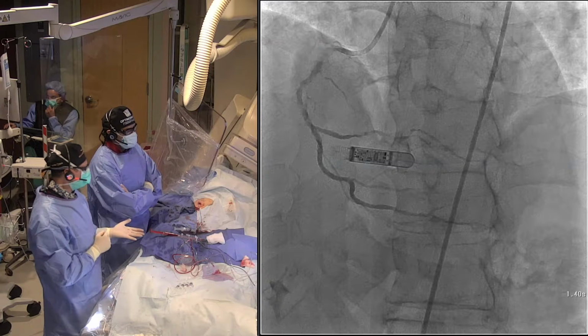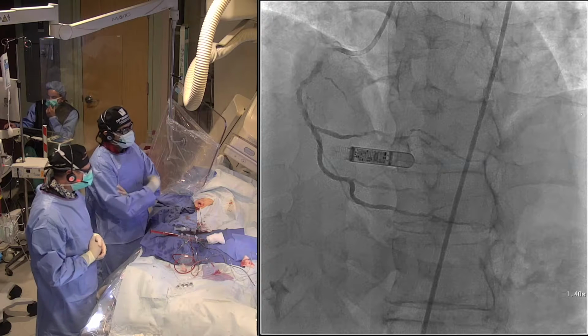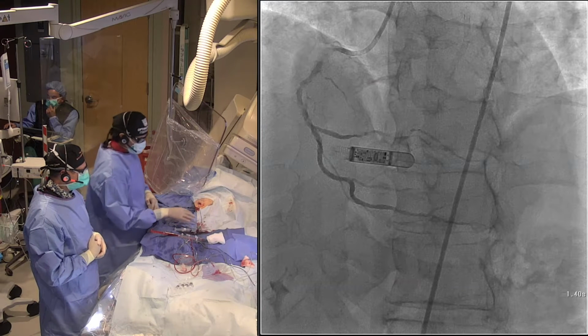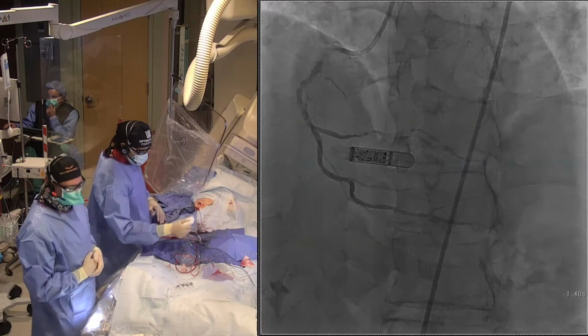Apparently the shaft itself has also been improved like a workhorse wire, and so we can actually stent over it. I just want to be able to hang the guide out to equalize. Okay, so we'll be able to do that. Let's get it started.